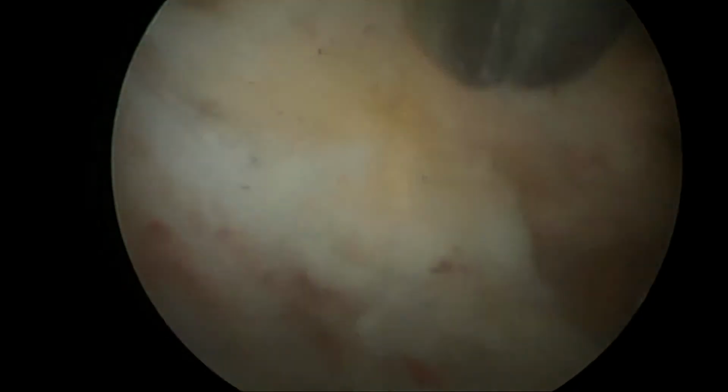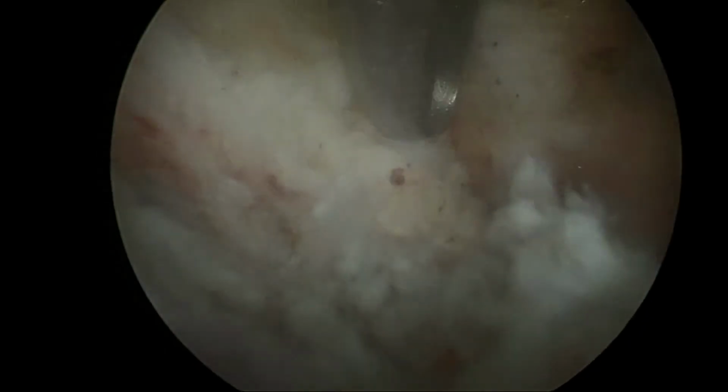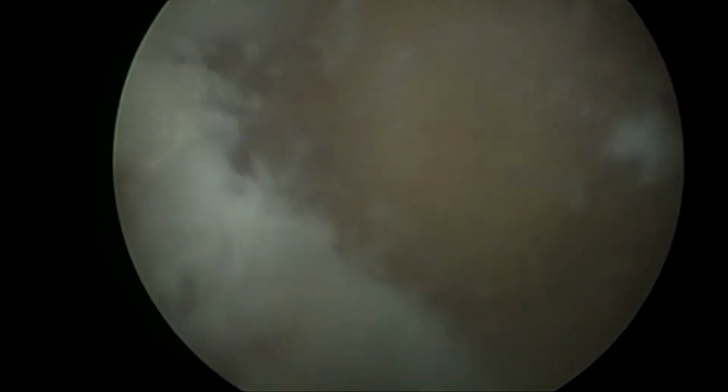Here, additional layers of the ligament are required as there is a remaining shelf of the descending facet process that needs to be drilled. Once the yellow ligament is released, it facilitates entry of the drill. I use lateral fluoroscopy intermittently in order to make sure that I get rostral enough with the drilling at the level of the lamina.